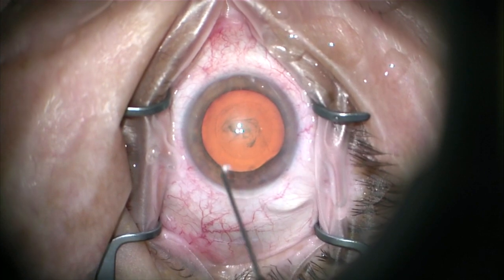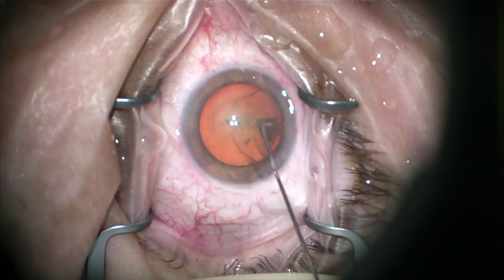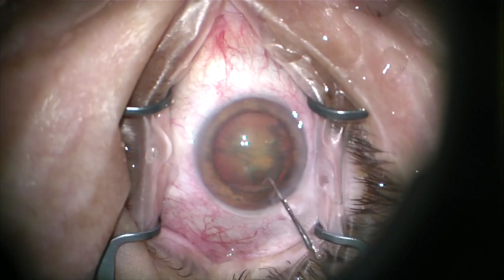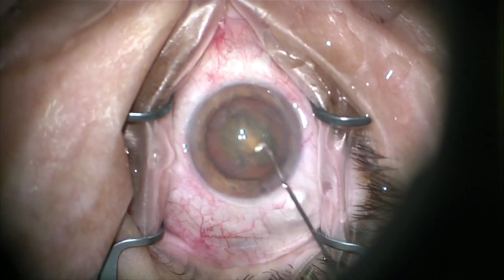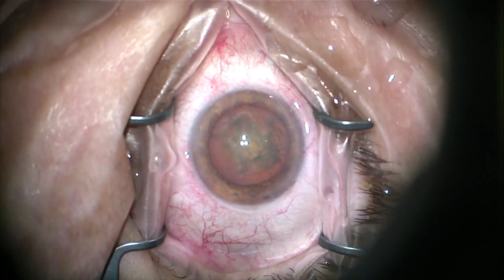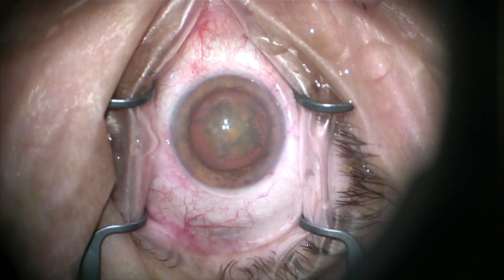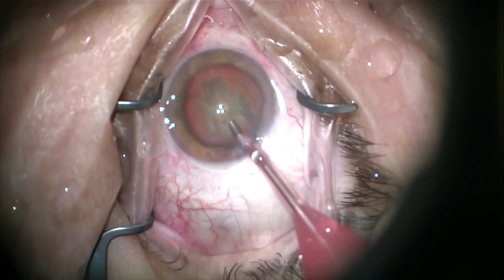Remember the capsulorrhexis is like shooting pool — you want to set yourself up for the next shot. This is the chain cannula; you see we got a good fluid wave. I think the chain cannula is absolutely the best thing for hydrodissection. I go ahead and hydrodissect in a few other places because you really want to get a good hydrodissection. I don't feel like it has a lot of value to spin the lens — a lot of people are adamant about that, but I don't spin it every time and I usually do fine. When you start doing femto cataract surgery — LensX, Catalyst, whatever platform you've got — if you have sticky cortex to the anterior capsule leaflet, use the chain cannula. My partner taught me that; I used a regular cannula for years and switched to the chain once we got the LensX. Made my life a lot easier.